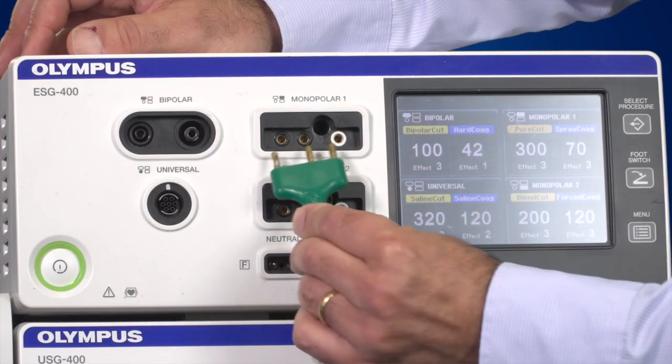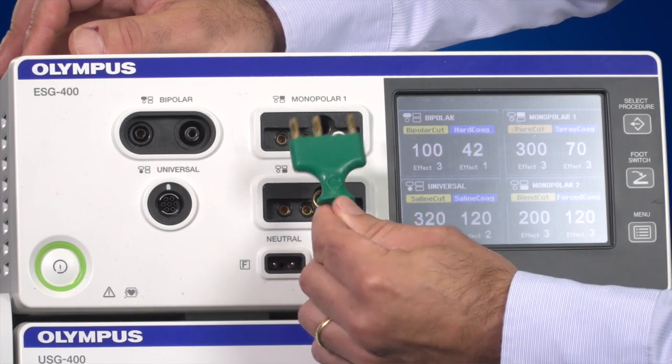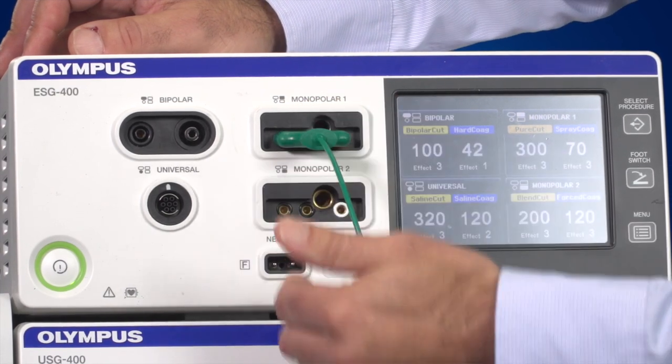If you use the 3-pin international standard plug, you can only connect it in one direction. This can be plugged into either a Monopolar 1 or a Monopolar 2 socket.